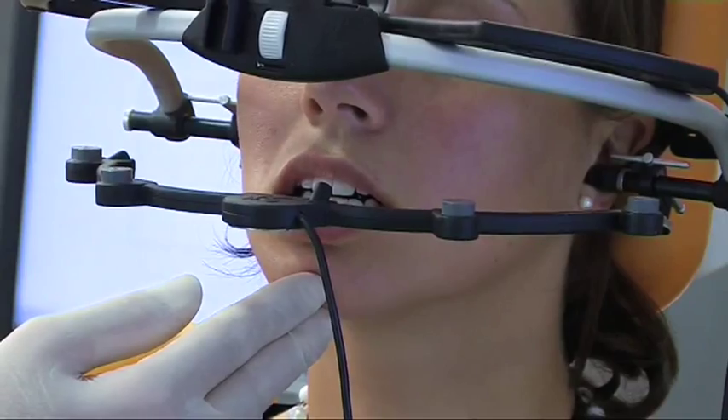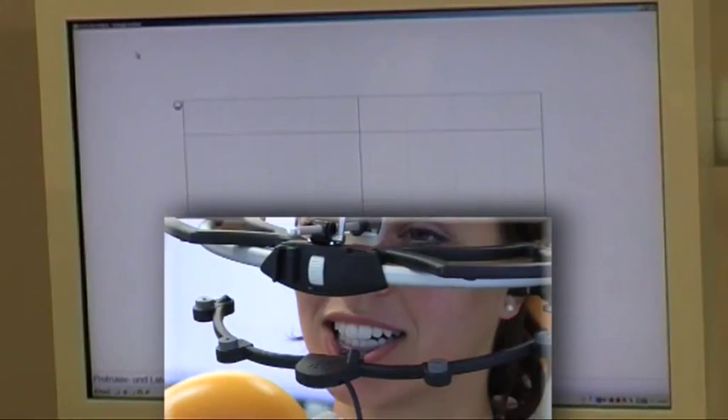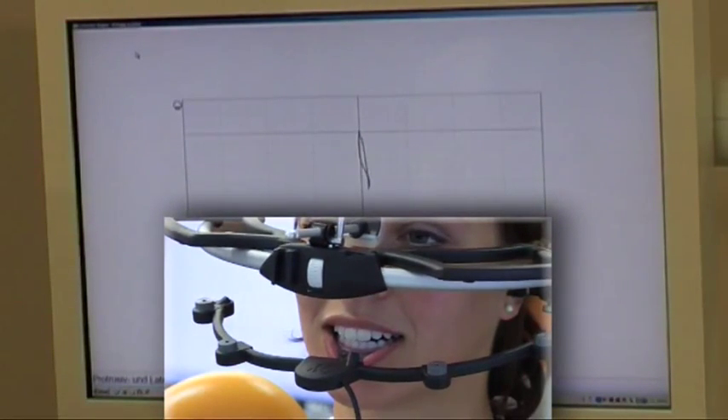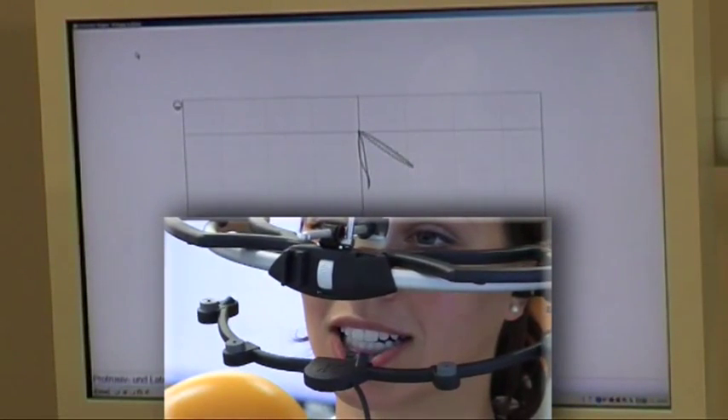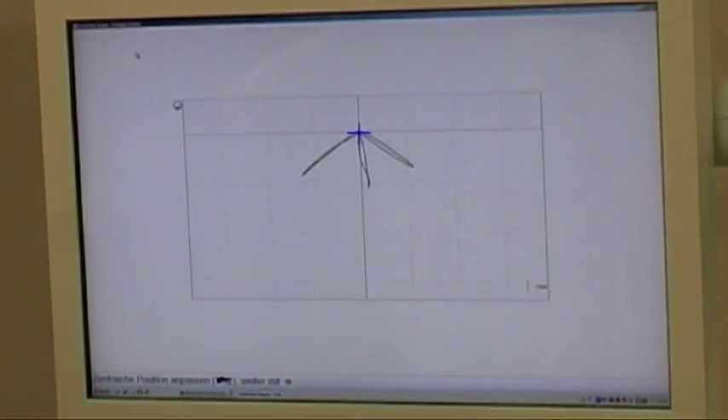Hold this position. From this position the movement recording is started. Move the jaw forward and then back. Now move the jaw to the right. Back to the middle. The measurement is ended and I select the tip of the arrow as the position where I want to make the centric registration.